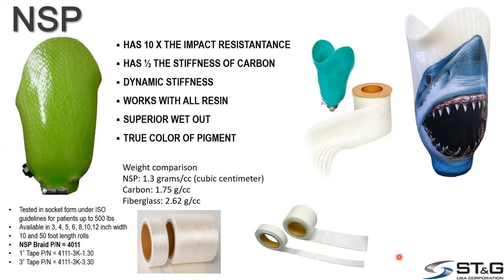NSP, as it's manufactured, is not coated like carbon fiber. So it actually will saturate with the resin very easily. The nice thing too is because there is no coating on it, we don't have to deal with all these fibers that are coated that won't saturate and trap air. So that's one of the reasons why carbon fiber tends to have more air problems. You're actually trapping air with all of the fibers that are coated.